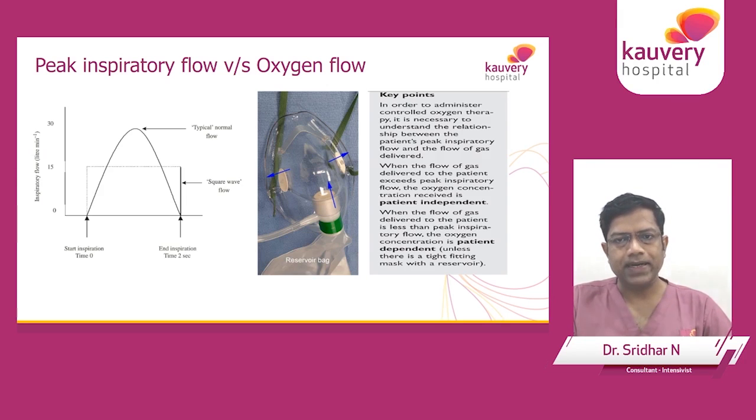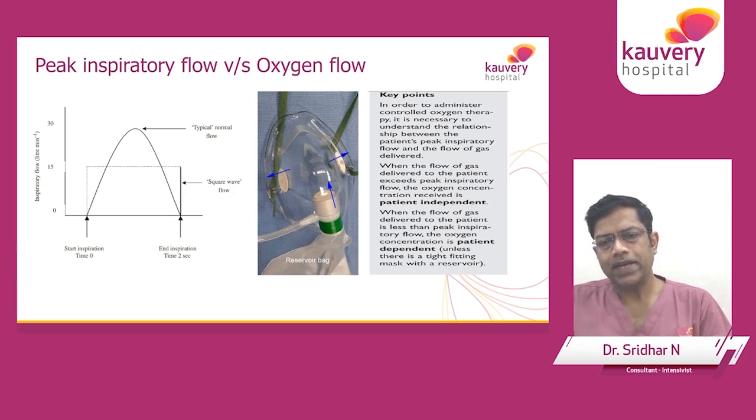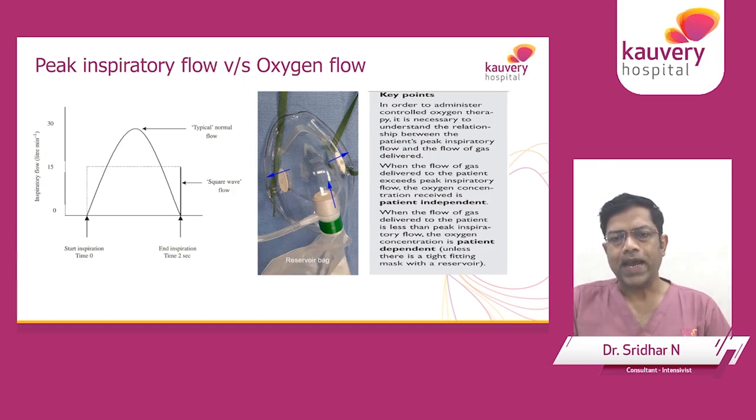This is one of my favorite devices now, and it's very important to use it properly. This is a non-rebreathing bag. The blue arrow shows oxygen coming in and filling the reservoir bag. Before putting this device onto the patient, it's important to use one of your fingers to occlude the device where you can see the blue arrow, where the reservoir bag meets the mask. Make sure that the bag is filled up to about 500 mLs of oxygen and only then put it on the patient.